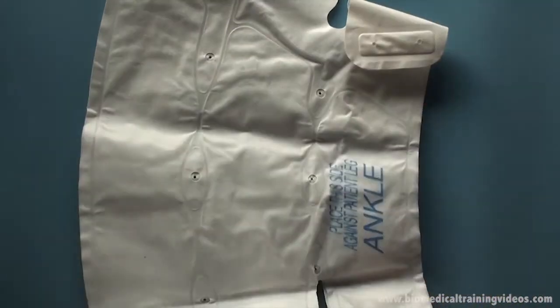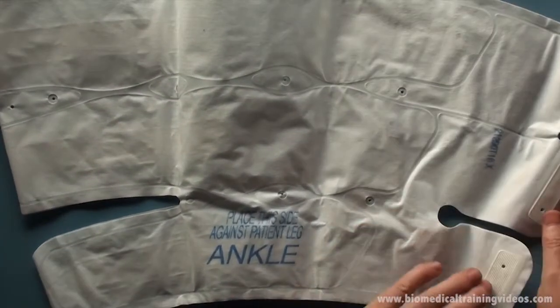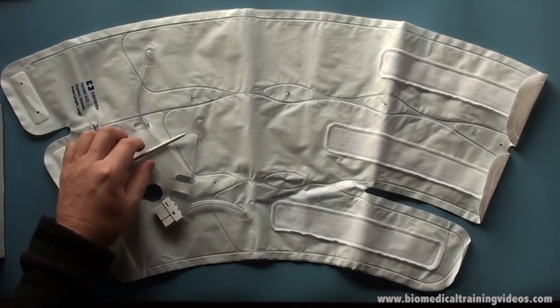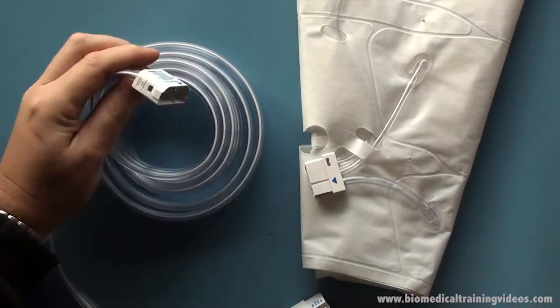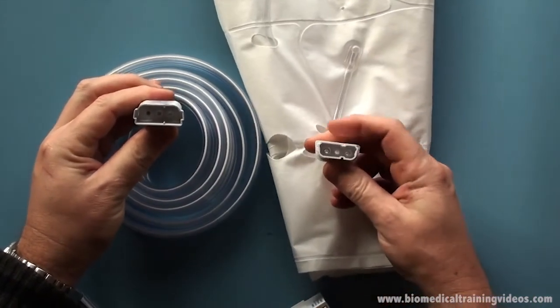The smaller part is wrapped around the ankle. I am just pointing out the three individual cuffs and three hoses, one going to each. This is the interconnecting tube, so this is not a disposable part — the cuffs are.